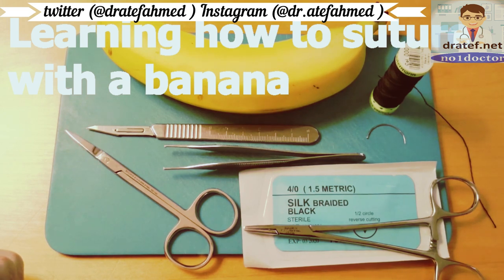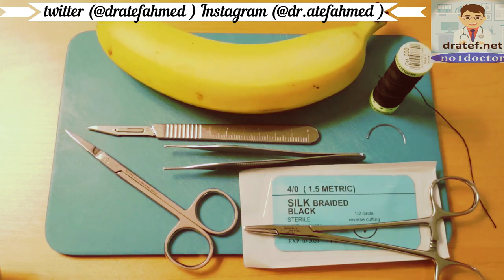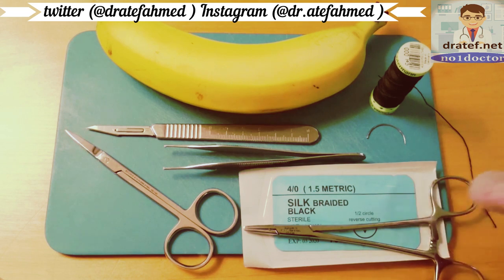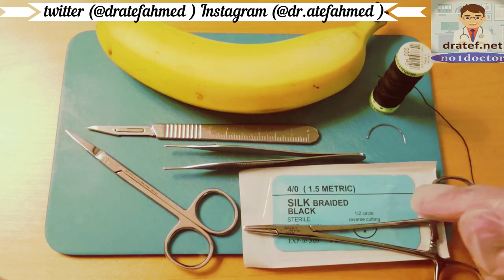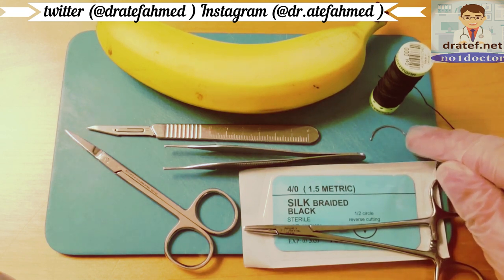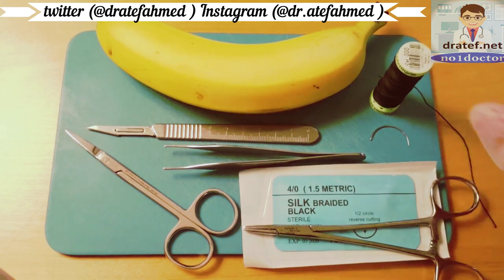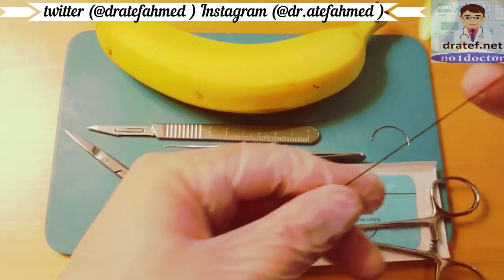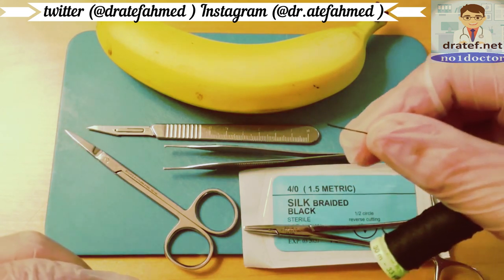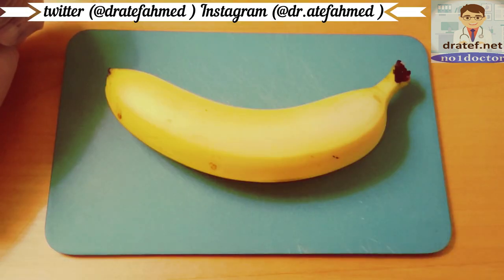This is a basic introduction to suturing technique. The equipment used is a suture driver, scissors, tweezers, a scalpel, and a suture needle with prepared thread. Alternatively, you can use a curved upholstery needle which is a little bit thicker — I recommend using thicker polyester thread when training.